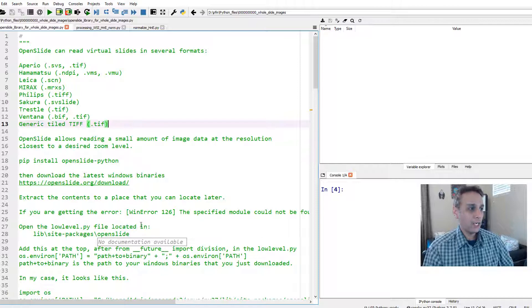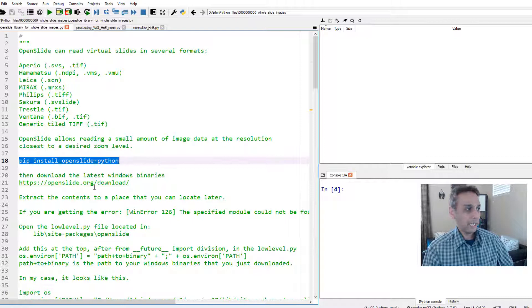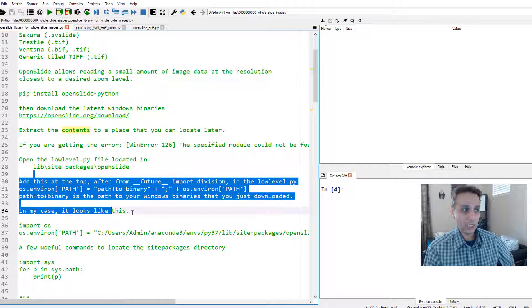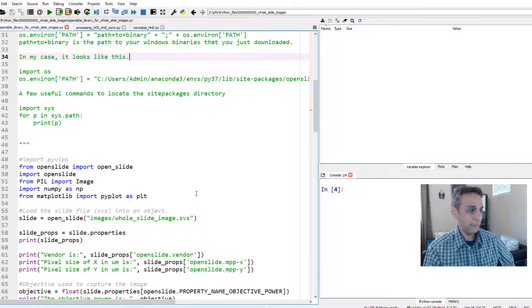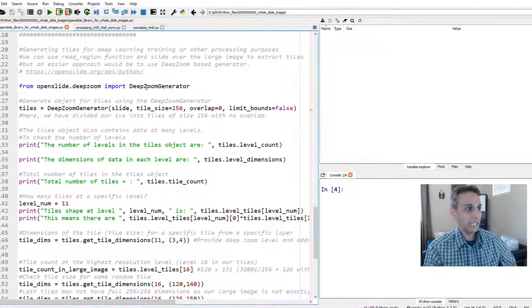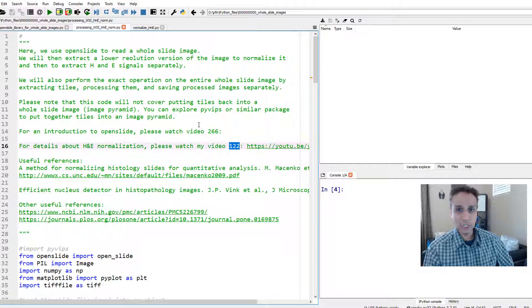This code is from the previous video. To install the OpenSlide library, go ahead and pip install openslide-python, then go to this location and download the Windows binary if you're working on Windows and store it somewhere. If you get some error, go ahead and add it to your path. I covered this in the last video. So now let's jump into how we can use this approach — basically using OpenSlide and converting that into tiles using our deep zoom generator, and then normalize each image.